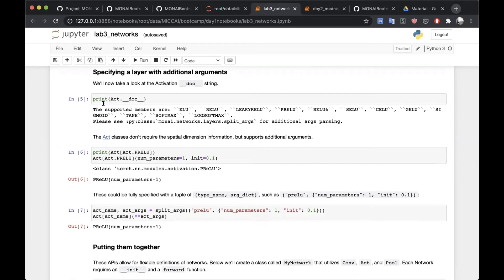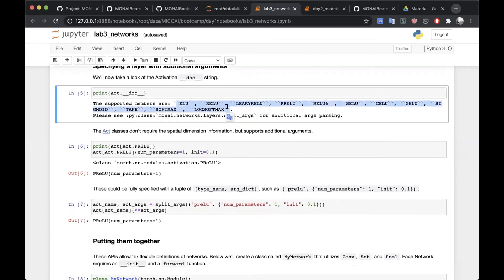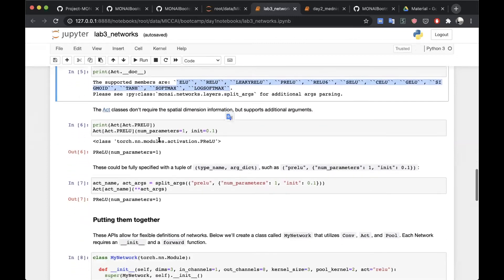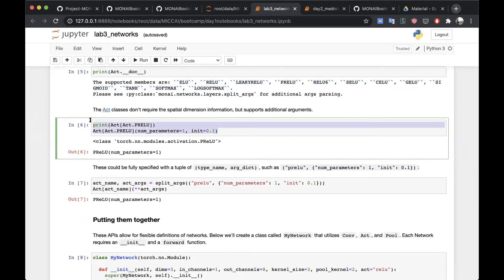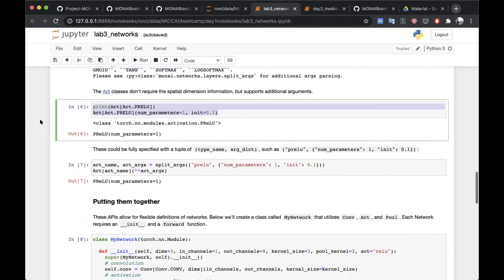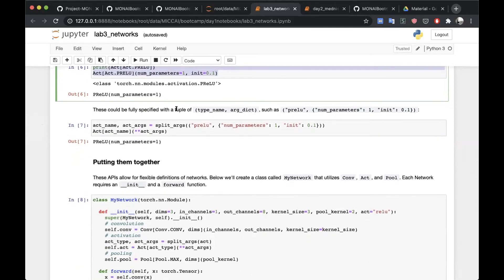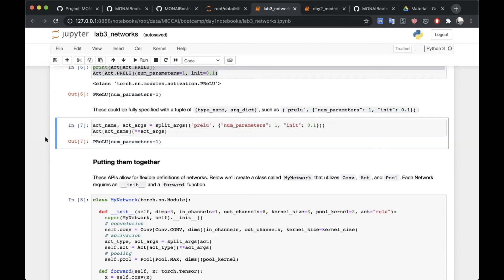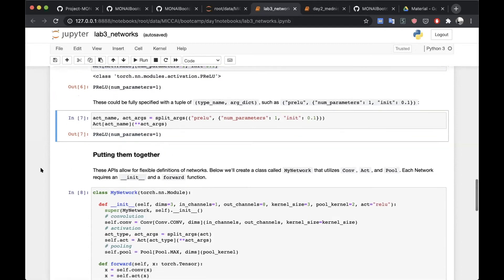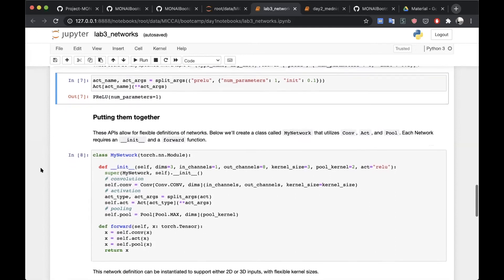We can create an instance of it by passing in the arguments for the number of channels and kernel sizes, and then we can print that — whether we want it to be 2D or 3D with various kernel sizes. Then we have a look at activations — you can see there are loads of different types of activations available. We can create them in the same way as we did with the convolutions, and on top of that, we can do it with a tuple where we give it the name and a dictionary of arguments. So there are multiple ways of achieving the same goal.